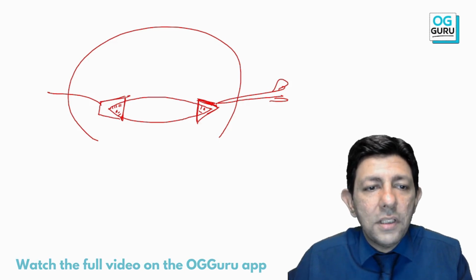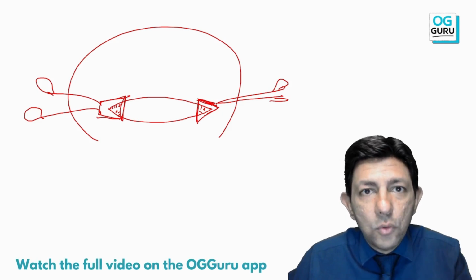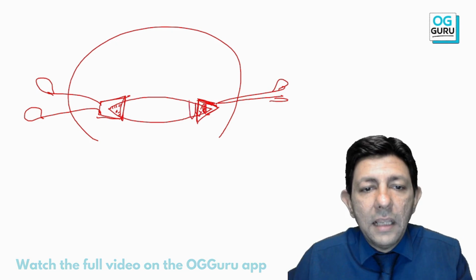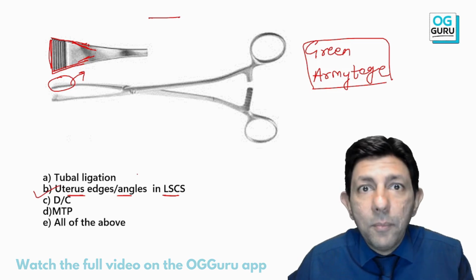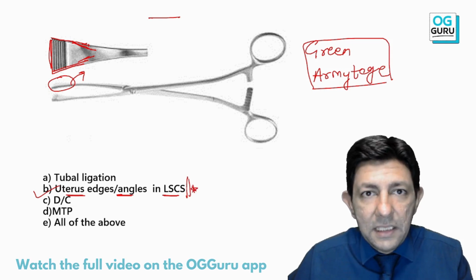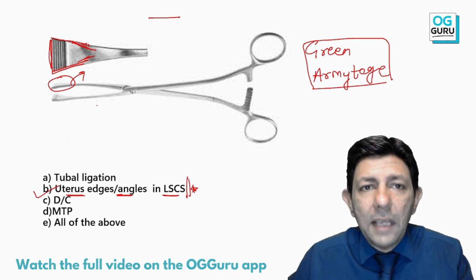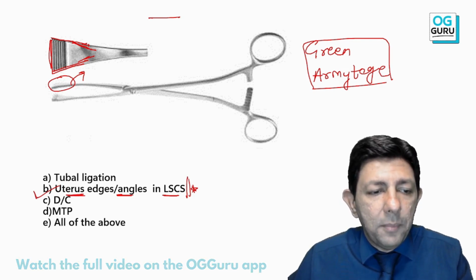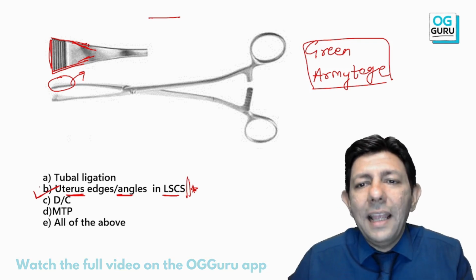It is to temporarily clamp, temporarily hold the uterine edges and angles, and then of course you start suturing, and once you take the stitch, you remove it, and then of course you suture the whole lower uterine segment. So this is a very important instrument, to hold uterine edges or angles in LSCS. If this instrument is not available, then many times even Alice forceps can be used also, but preferably this is used. So this is one and only one indication. It is for LSCS surgery.